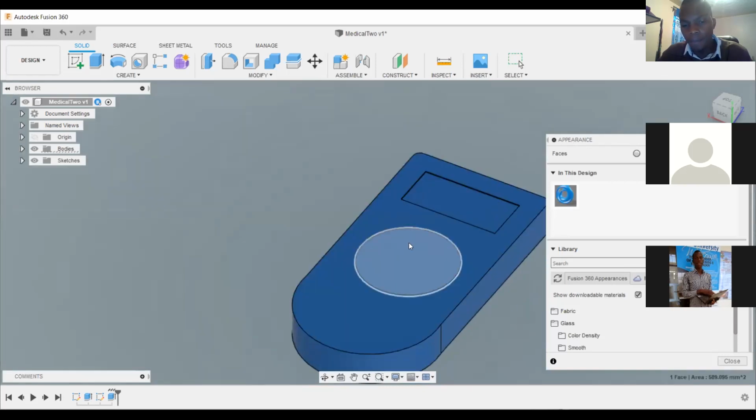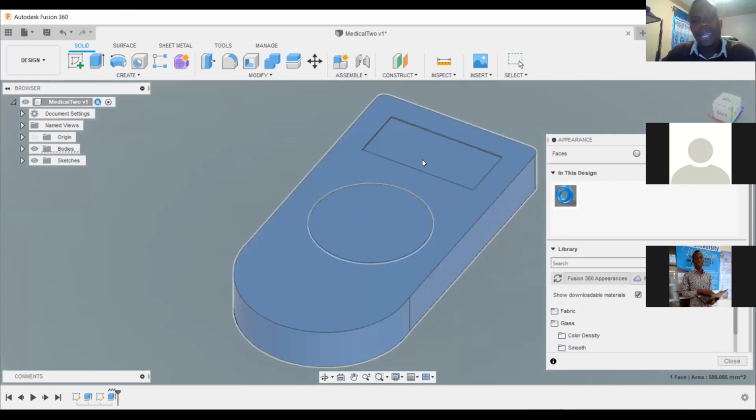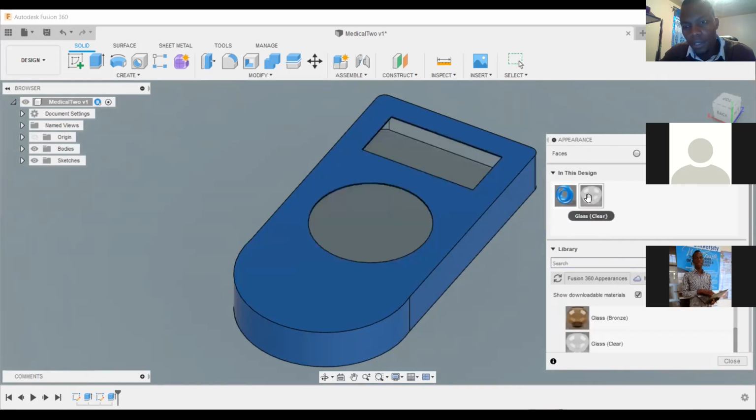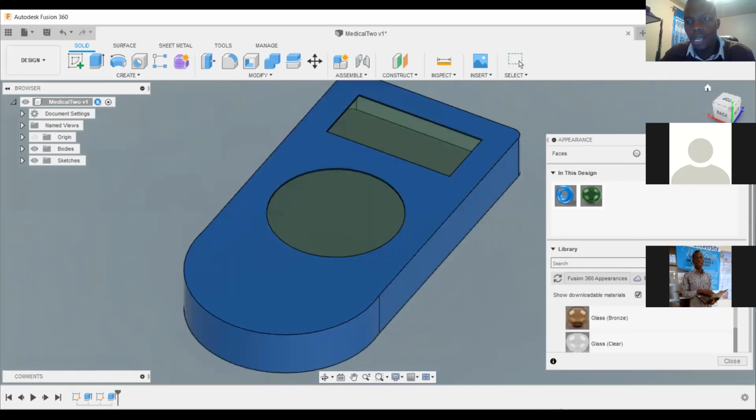Okay. But the middle one here, you want it. You can even put some writings. Like this screen, you can decide to do glass. You can choose the color that you like. I'm just showing you that these are the things which are available to you.